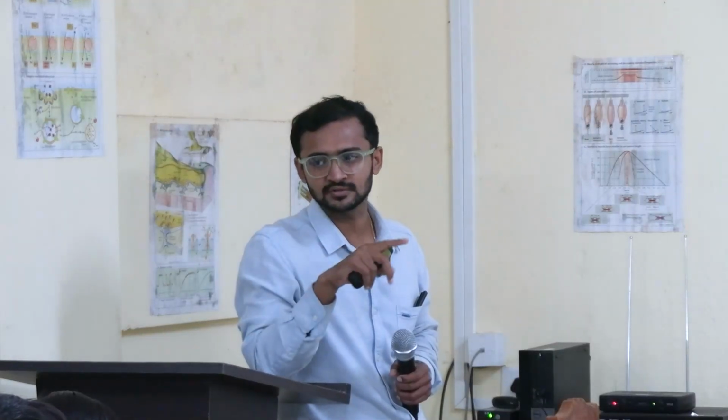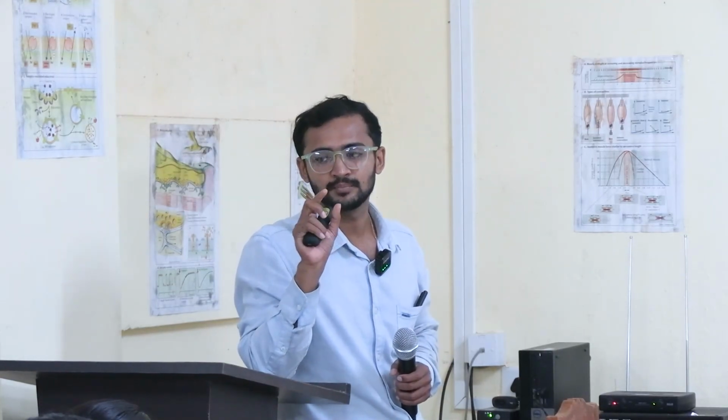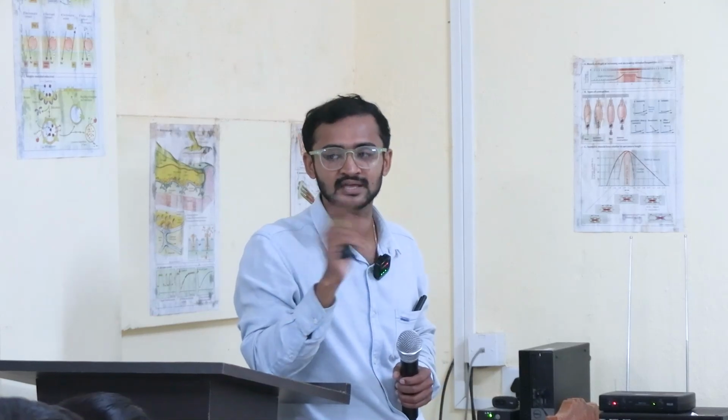The sinus venosus receives blood from the right and left superior vena cavae and inferiorly from the inferior vena cava. This is the triangular portion. This is the pacemaker of the frog's heart, from which the impulse is generated, like the SA node in humans. You can compare it with the SA node.